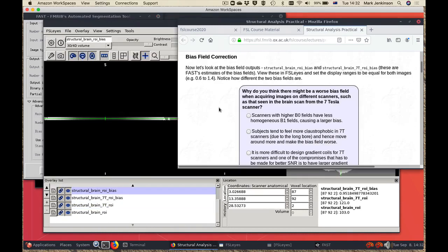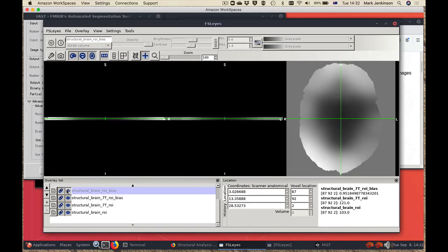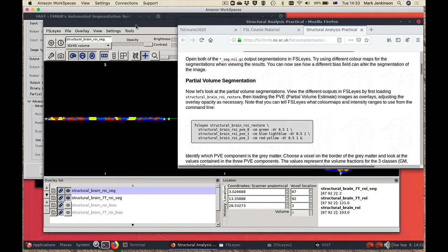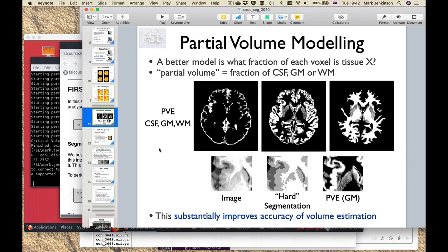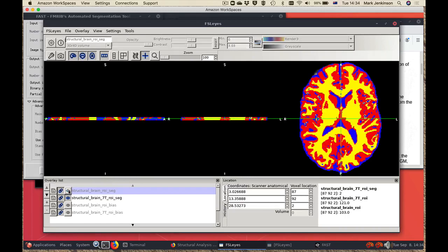Once that's finished we're going to look at the bias estimates that it outputs. These two are very different — one was estimated on the 7T, the other on the 3T. We've set the minimum and maximum display range to be the same in each case, which is helpful when looking at images with quantitative values. After that we'll look at the segmentations. This part relates to looking at both the hard segmentation, which is the underscore seg output, and the partial volume estimates, which are underscore PVE, where you would see three different outputs. The hard segmentations should look something like this and you can see they're substantially different.